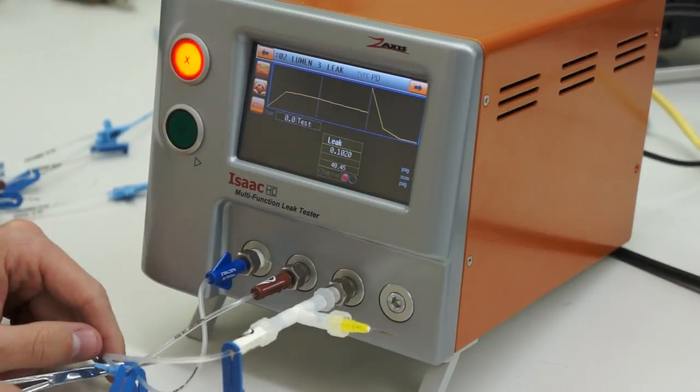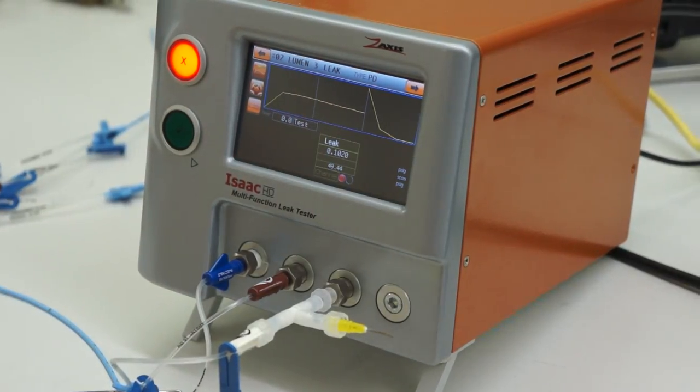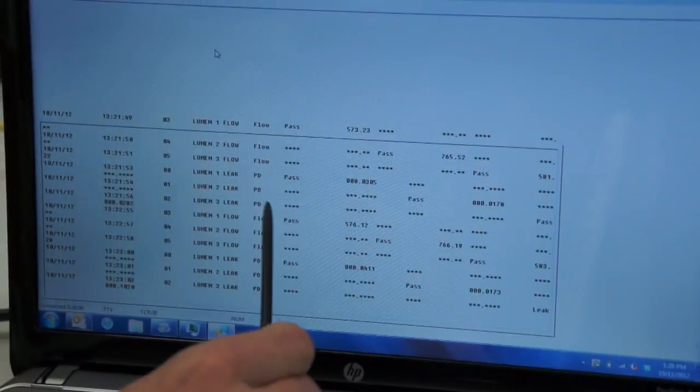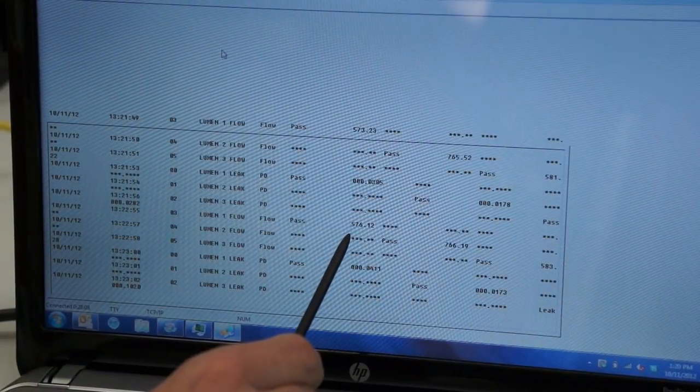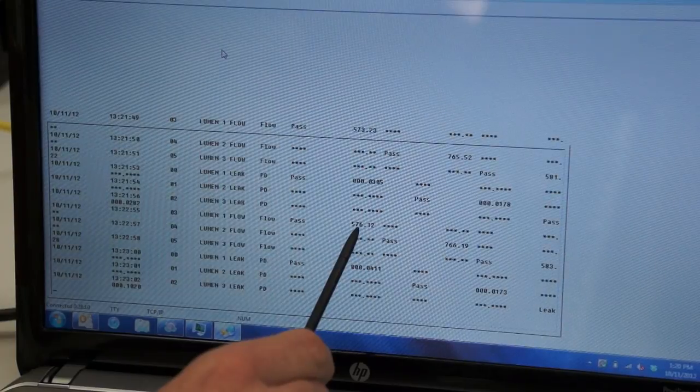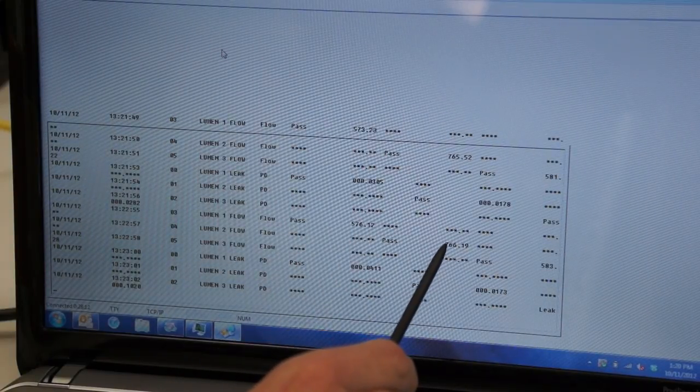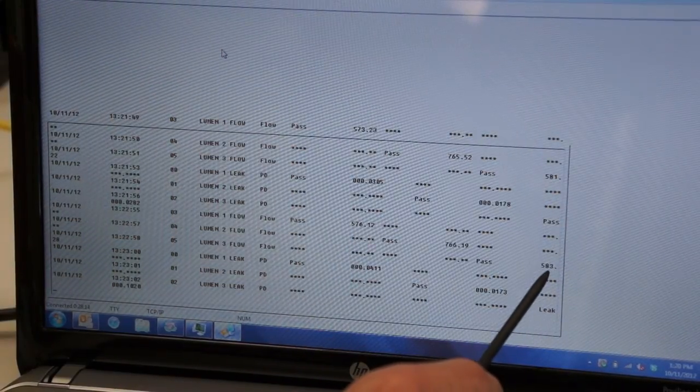We're going to record a failure on channel 3. If we go back over to the computer screen, we'll see that we got 576 on the flow test for lumen 1, 766 for lumen 2, and 583 for lumen 3.